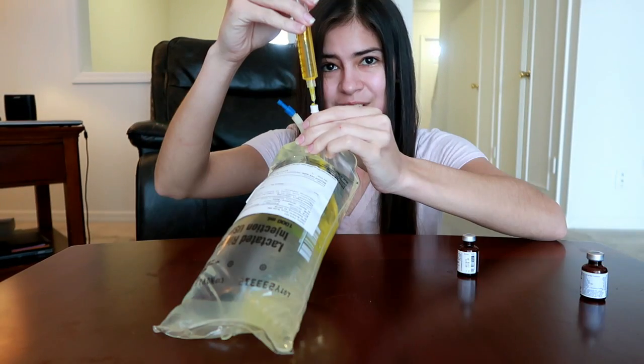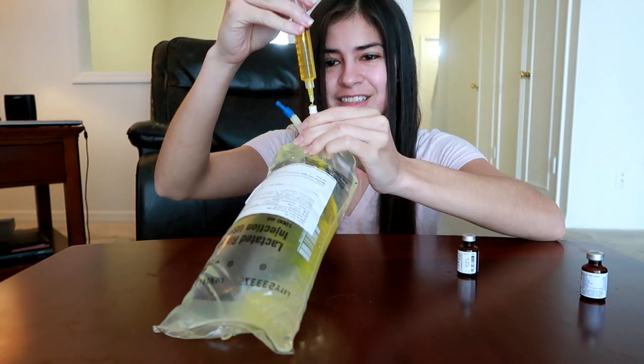Let's mix up my first banana bag. It's turning yellow. Things are not going well, and it is scary.